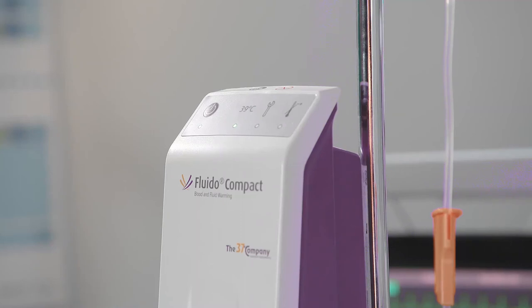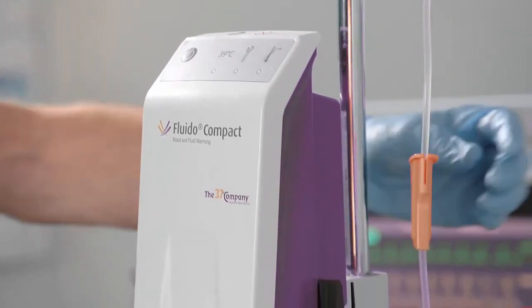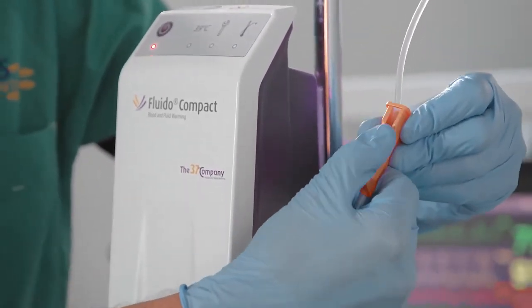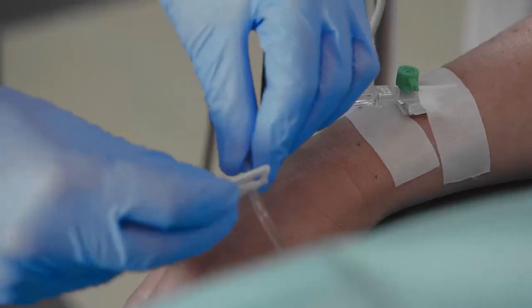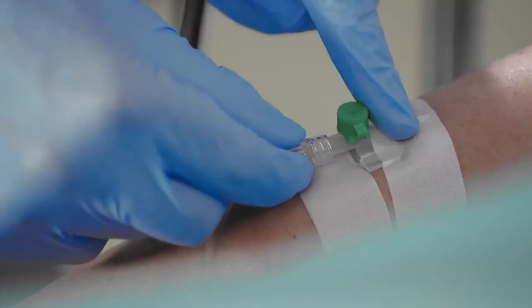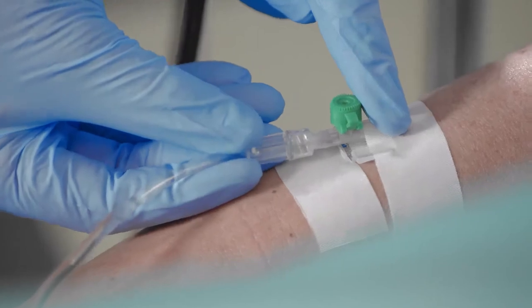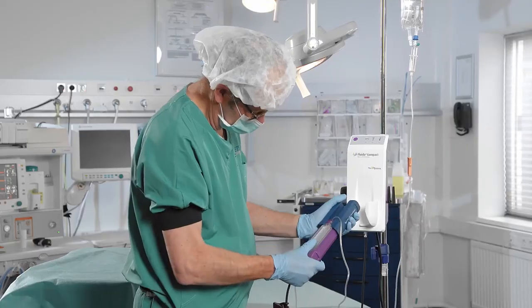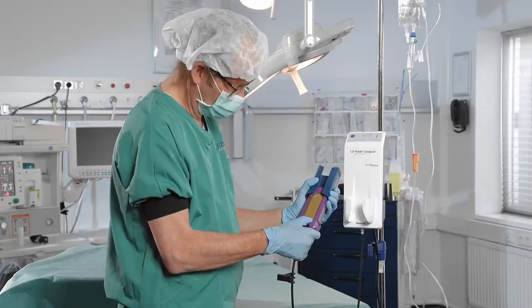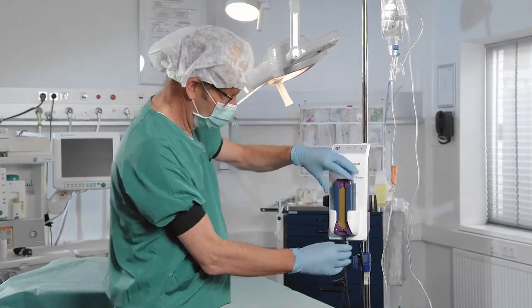To stop the system, push the standby and on button on the control module. The status indicator LED of the warming module is now orange. Close the roller clamp of the hospital administration set and close the slide clamp of the patient line. Disconnect the patient line from the IV catheter. Now open the slider and remove the disposable set from the warming module. Place the warming module in the warming module holder and dispose of the disposable set.